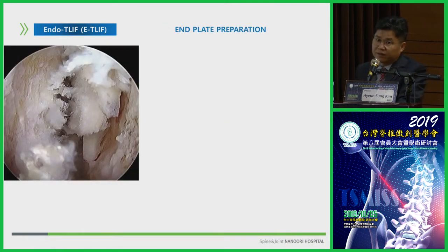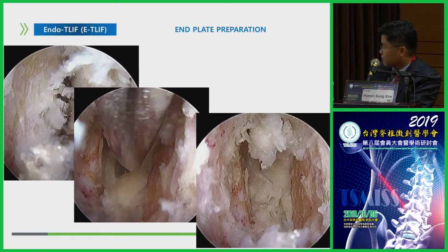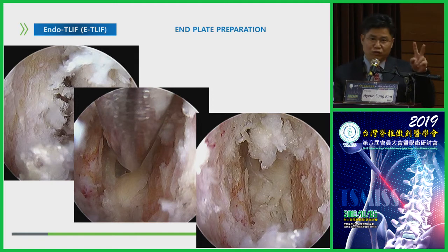The second advantage, which I think is the real advantage of endoscopic fusion surgery, is that we can see the endplate clearly under the view, and can denude the endplate from the vertebral body and preserve the endplate nearly completely. This is the real advantage of endoscopic fusion surgery. You can see here the denudation of the endplate without damaging the vertebral body, and you can see a clear view.